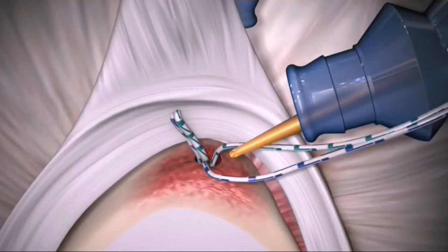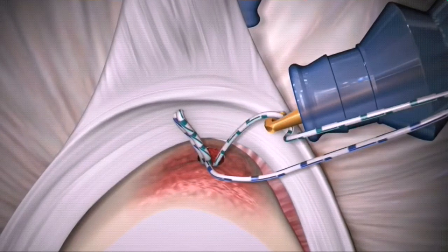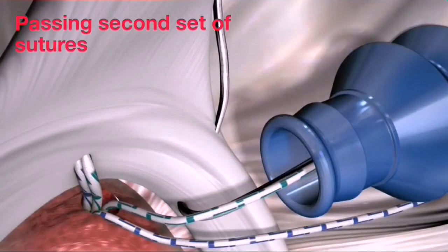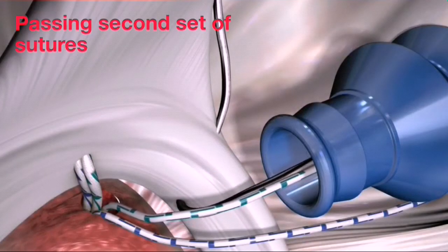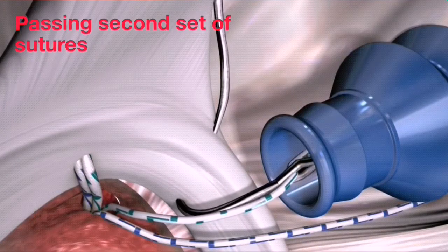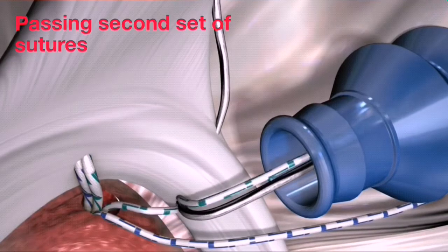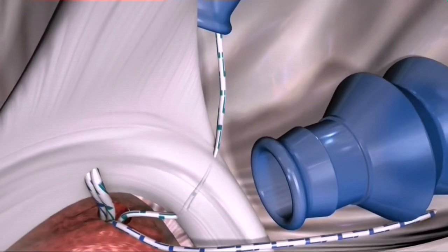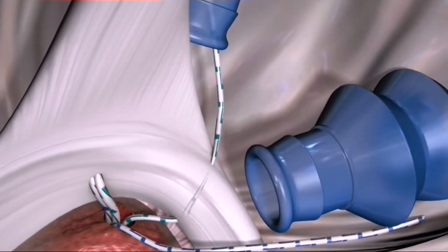Using a crochet hook, retrieve one of the limbs of suture from outside the anterior mid-glenoid portal. Using the spectrum crescent hook, shuttle this second limb of suture back through the labrum, just adjacent to the anterior attachment of the biceps and closer to the glenoid, resulting in an anterior mattress stitch.